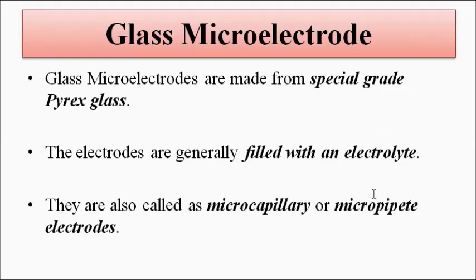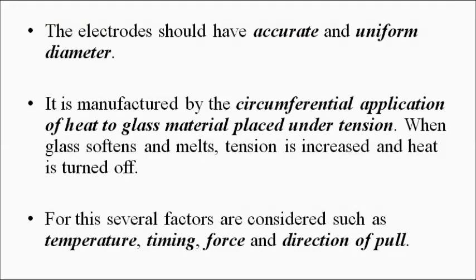That is the special characteristic of the electrolyte. Let us not go into that, we can cover that in a separate video. The glass microelectrodes are also called microcapillary electrodes or micropipette electrodes.